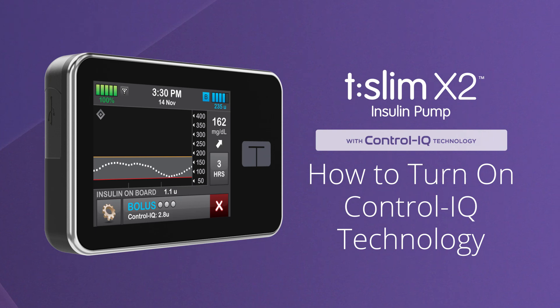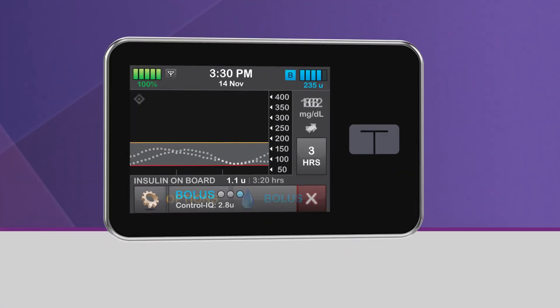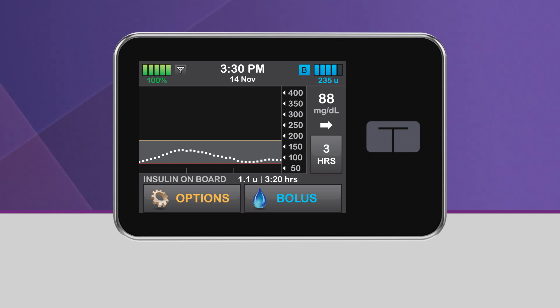Welcome. We're excited to show you how easy control can be using the T-Slim X2 Insulin Pump with Control IQ Technology from Tandem Diabetes Care. This video explains how to turn on the Control IQ Technology feature on your T-Slim X2 Insulin Pump. For more information about how Control IQ Technology works, please visit our website or consult your user guide.